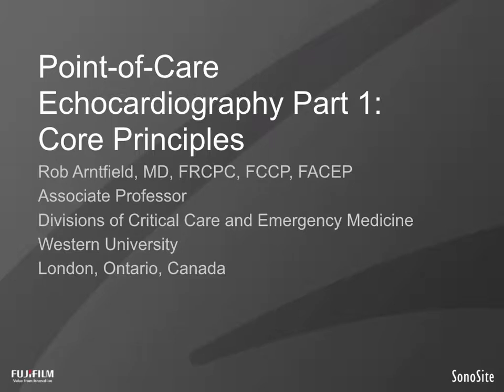This is Robert Arntfield speaking to you from Western University in London, Ontario, Canada. And this is the first part of a multi-part series on the topic of point-of-care echocardiography.